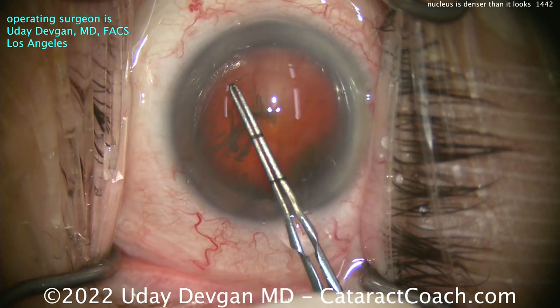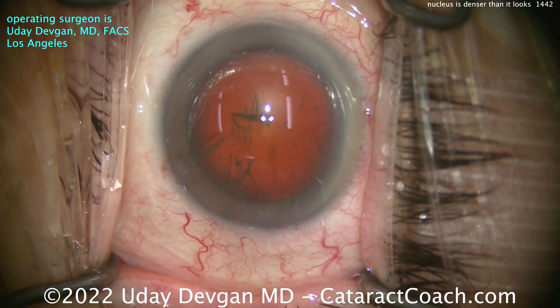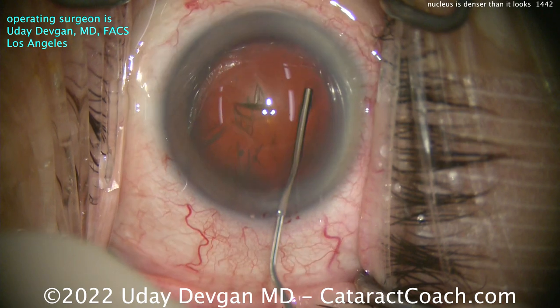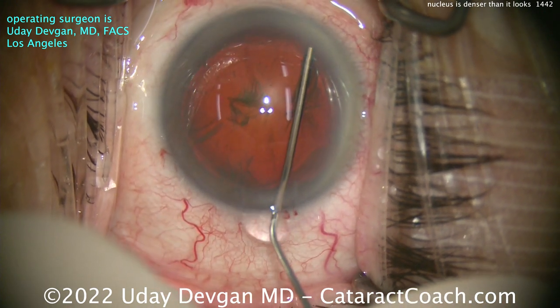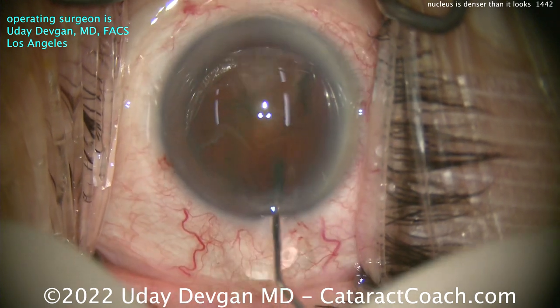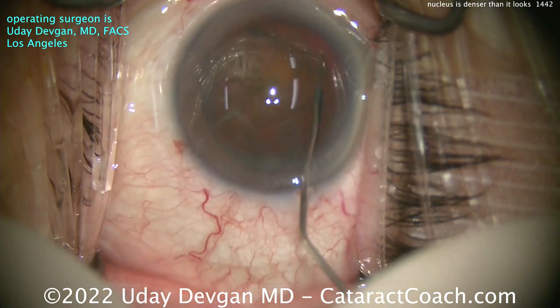Even after tens of thousands of surgeries, you'll realize there is no such thing as a perfectly routine or perfectly average case. So you've got to take things on the fly. A little bit of BSS going across to do the hydrodissection. That looks great.